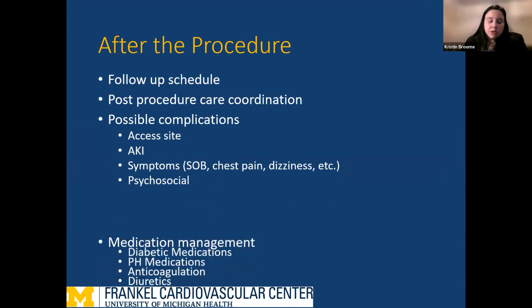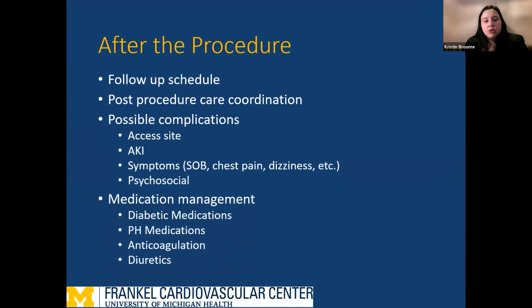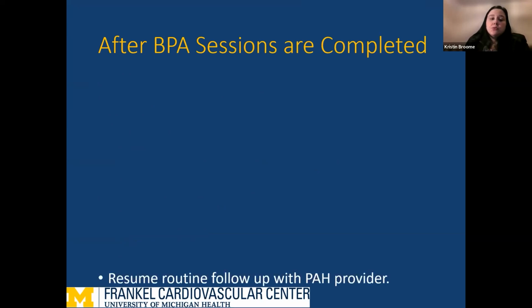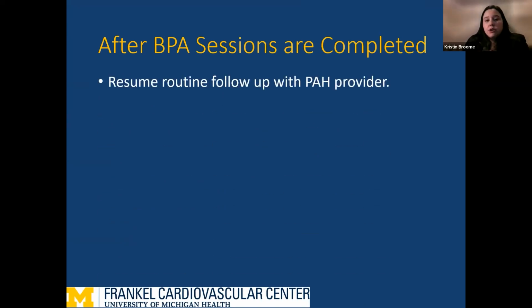And we also want to make sure that the patients are resuming their normal medications, including their anticoagulation. So after the BPA sessions are complete, they've completed their 4 to 8 sessions, the patient will resume routine care with their pulmonary hypertension provider.